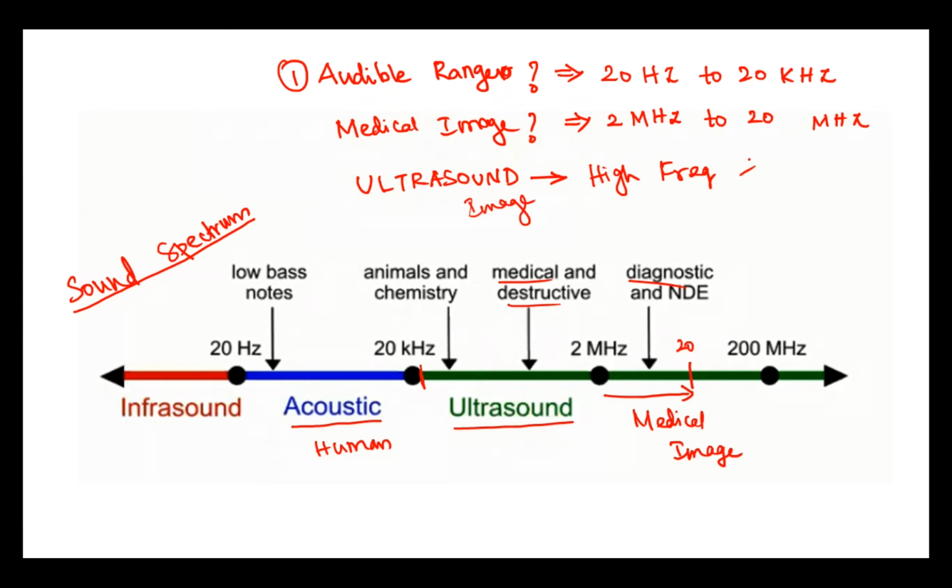Okay, so if you increase the frequency, definitely the resolution of the ultrasound image also increases. When frequency decreases, the image resolution also decreases.